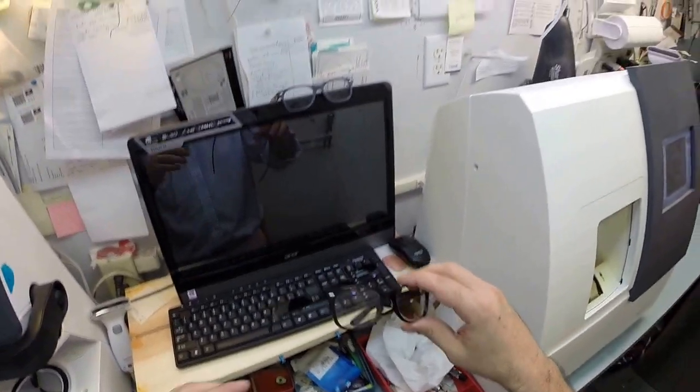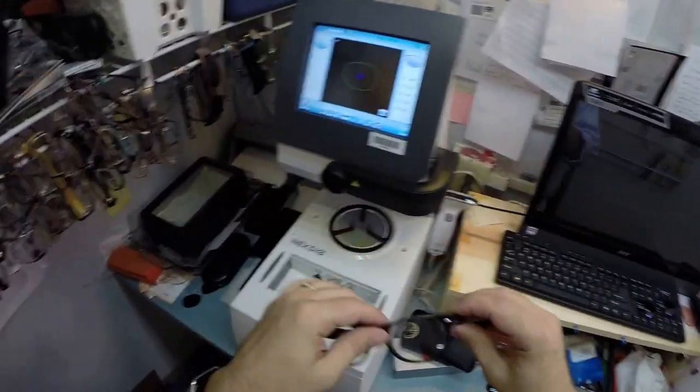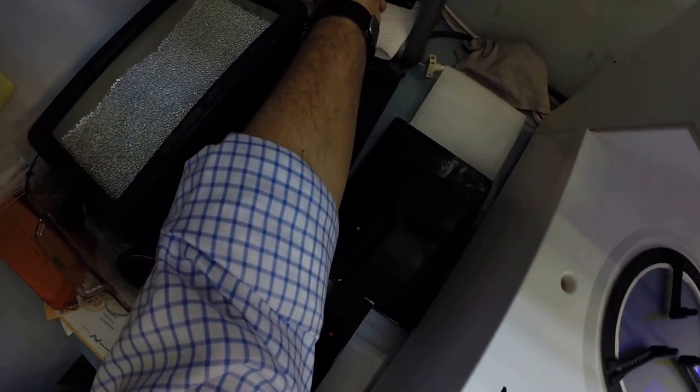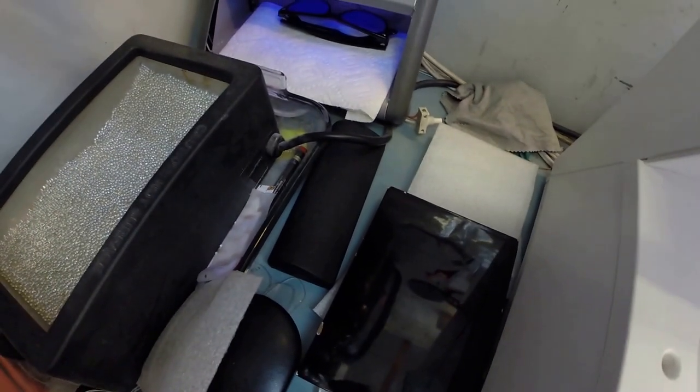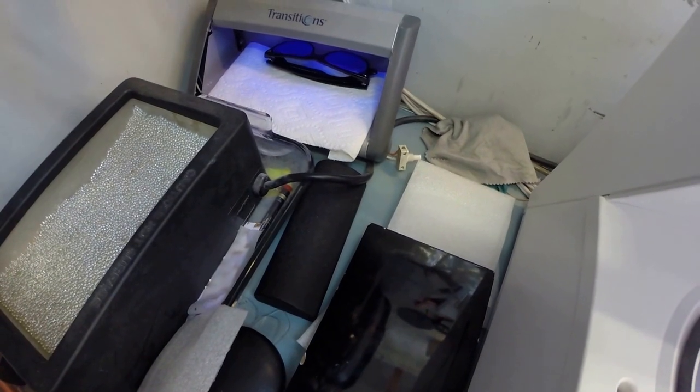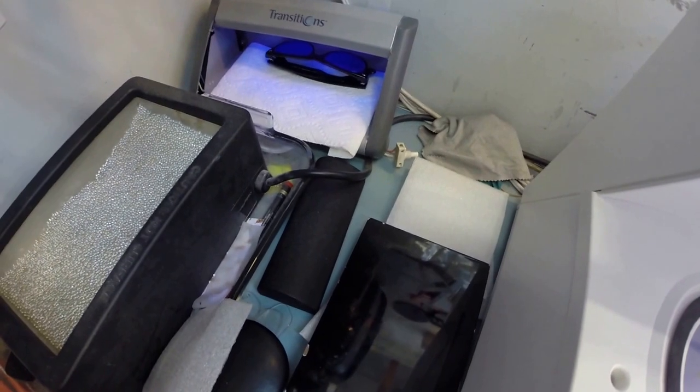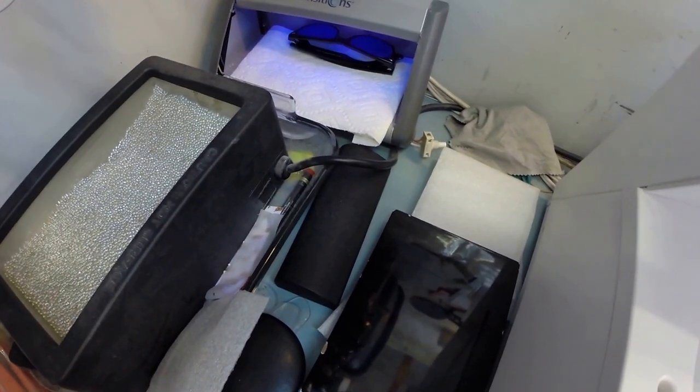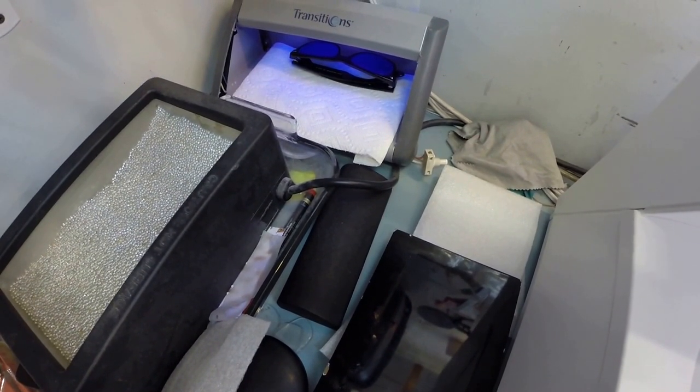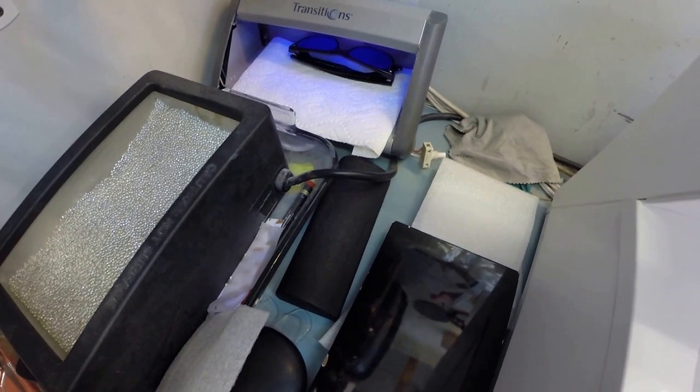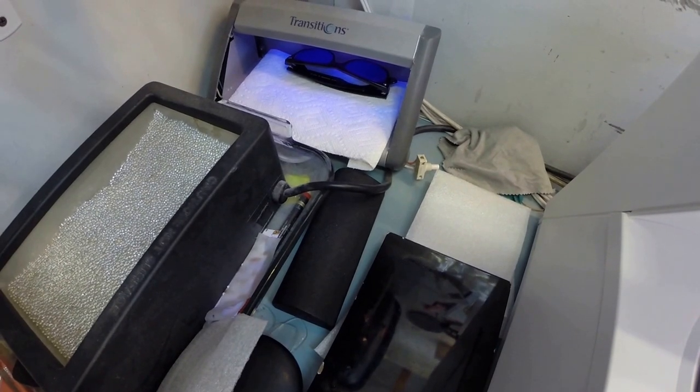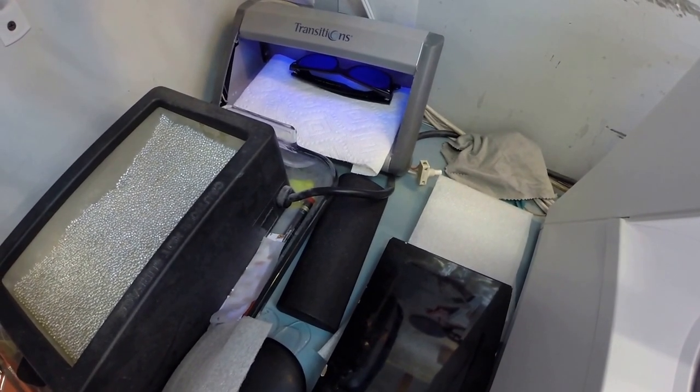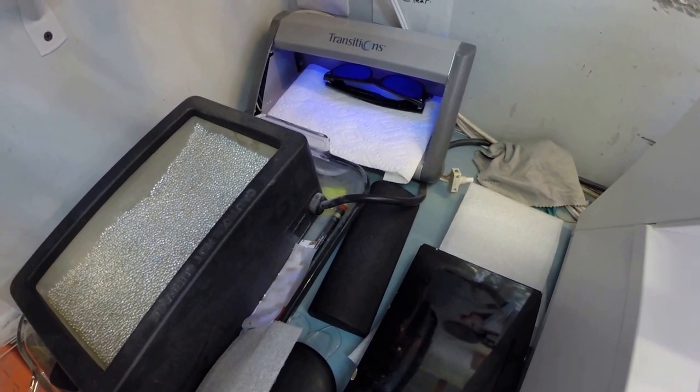So these are your frames with the clear lenses in there. I'm going to go ahead and activate them in my transitions box, which essentially just has a strong UV light. As you will see as I activate them, it takes about 30 to 45 seconds for them to darken when exposed to the sun. It takes a little bit longer when you come back inside, 45 seconds to a minute 15 to return back to clear. Now this is important, James, pay attention. All transition lenses will turn dark on day one, but give them two weeks. They're going to continue to darken every day of exposure to the sun for the first two weeks until they get to their final setting. After that they will work for years with maximum performance. The only time they will not work is if you're behind the wheel in your car. Your windshield absorbs all the sun's harmful ultraviolet rays so your dashboard doesn't crack from sitting in the sun.